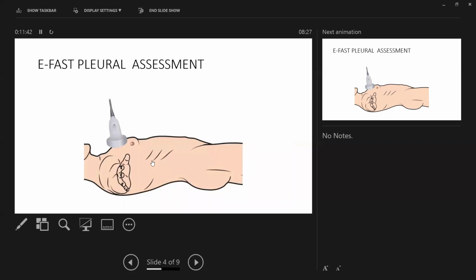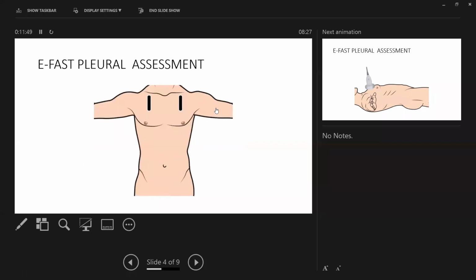Our next thing is going to be the intercostal view, looking for the presence or absence of pneumothorax. We're looking at the mid-clavicular line in the second intercostal space, right where you would needle decompress. Now remember, we are looking for large pneumothoraces that would impact our care in the trauma bay and need immediate decompression or treatment, not necessarily small pneumothoraces that can be evaluated further. With ultrasound, we're evaluating for the presence or absence of pneumothorax under the probe, meaning we are looking in a single spot, not excluding it throughout the entire thorax.